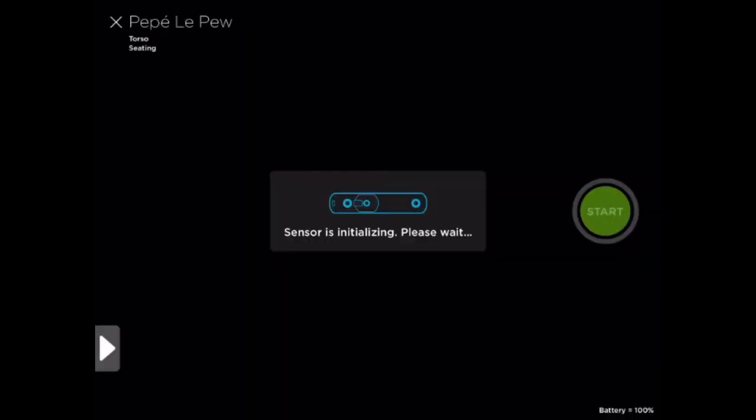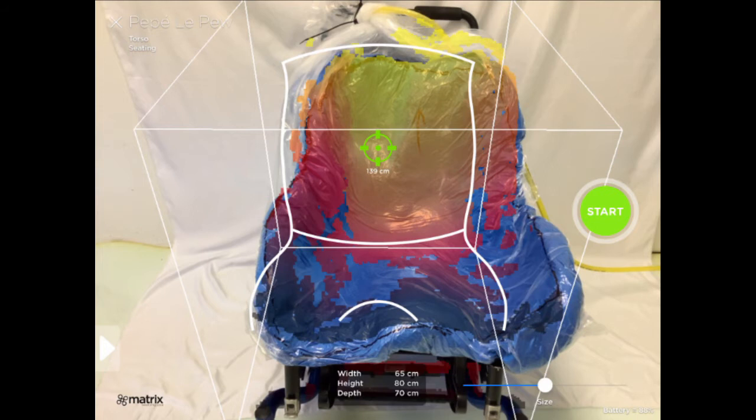The sensor will then initialize. Once the sensor is initialized, you'll see a screen with a seat outline appear with the patient's name in the top left hand corner. When you're ready to scan, click the green Start button.